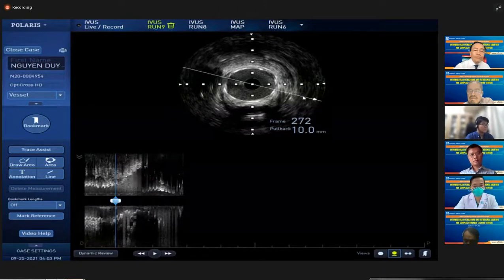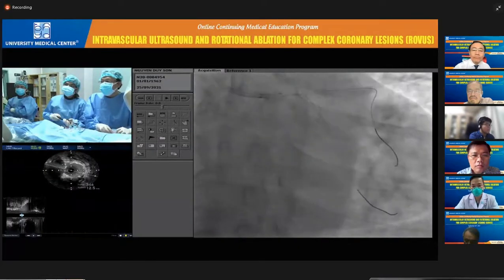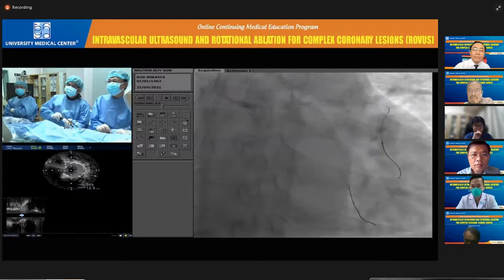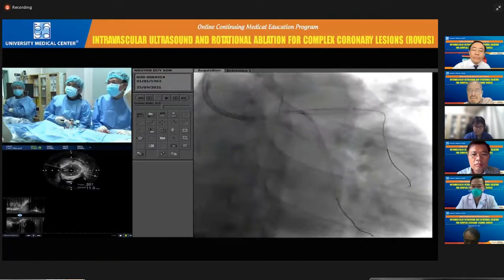Wow, quite difficult. I think we need to do 4 more. Okay. Open, please. Open. 12. This is 1.5 balloon. 12. Okay.